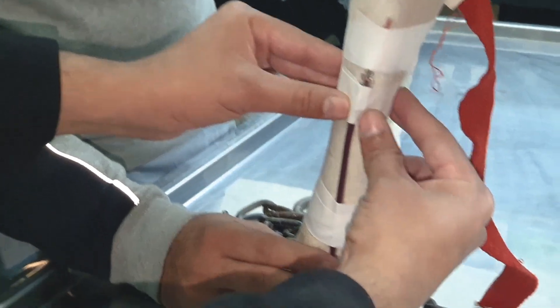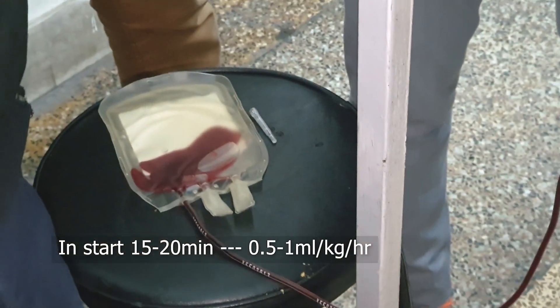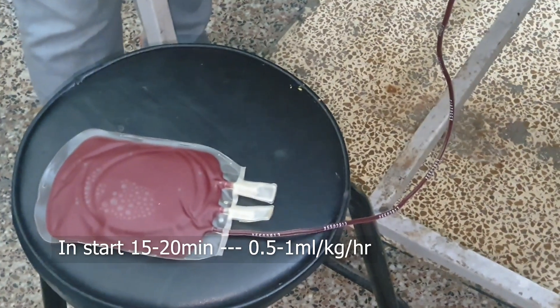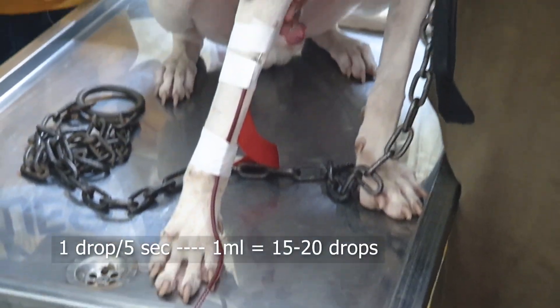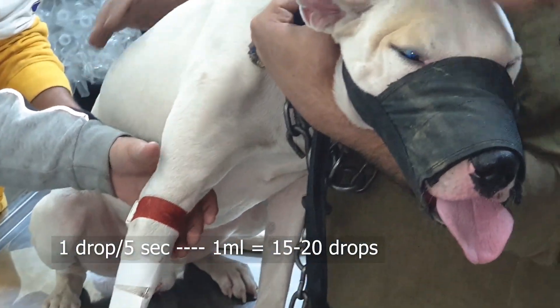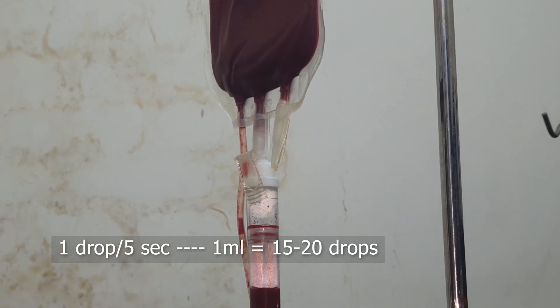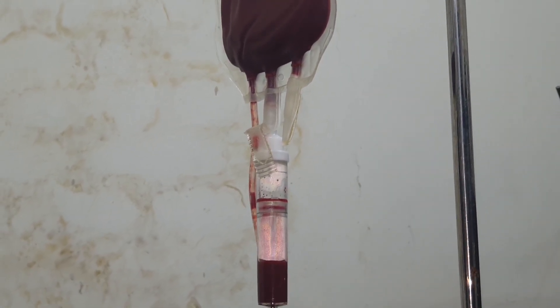Blood administration should be done at a very low speed — approximately 0.5 to 1 ml per kg per hour for the first 15 to 20 minutes. After that, we can increase the speed to about 1 drop per 5 seconds. Approximately 1 ml contains 15 to 20 drops.